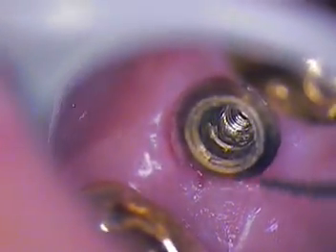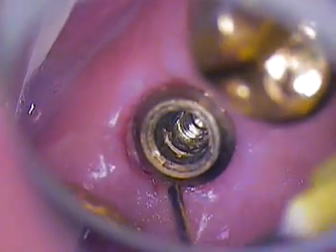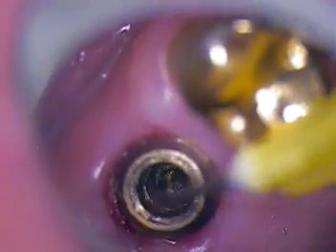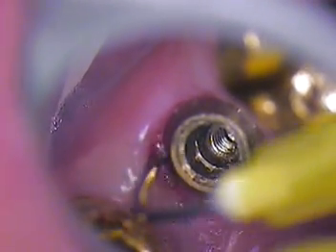So we're going to just suction away and turn that on. Let's see. Looks like our suction's on. Okay. And we'll keep going with that. And go inside. Yeah, you really lubed it up well. Alright. We need a little bit of that blue astringent material. And we're just suctioning up a little bit of this excess of tissue right back here.